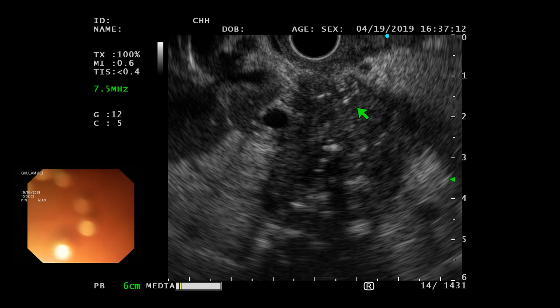So this is acute and chronic calcific pancreatitis. Khalid, can you measure the duodenal wall, please? Ji, bilkul.